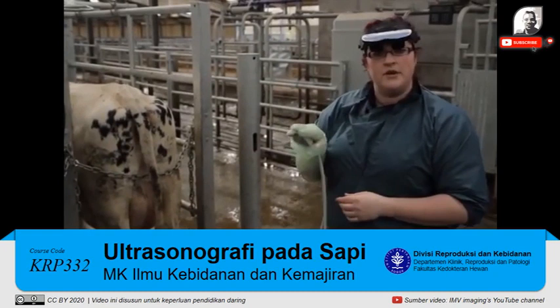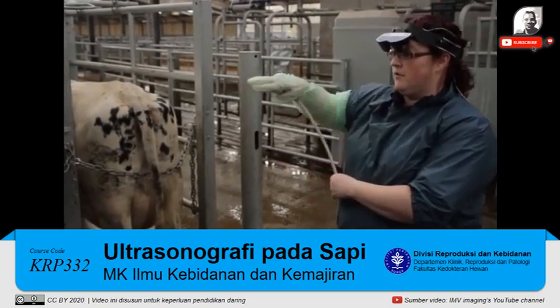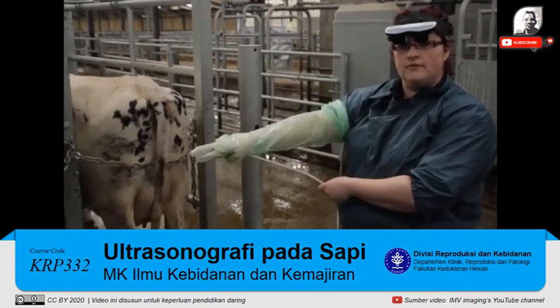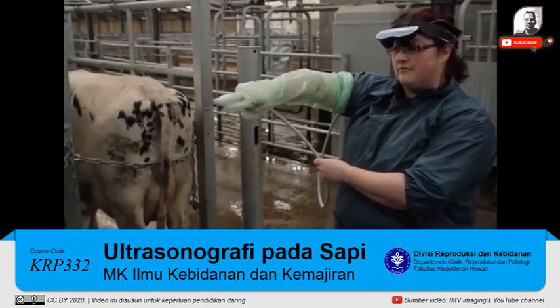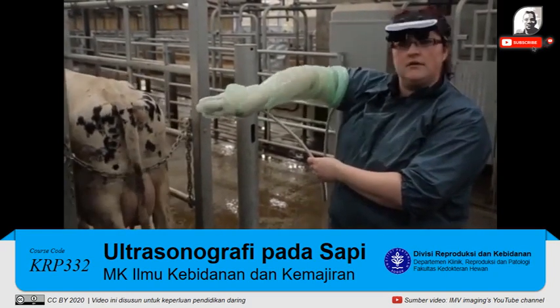The movements we can make are: move forward or back with pressure, rotating side to side, and rocking or tilting.